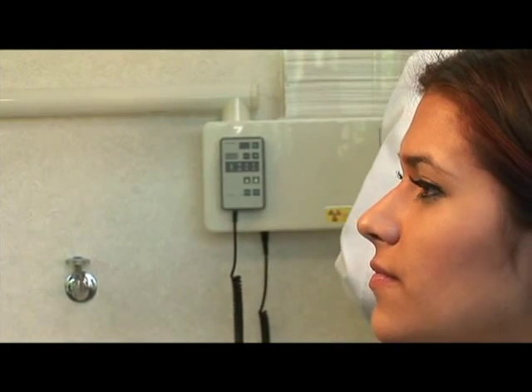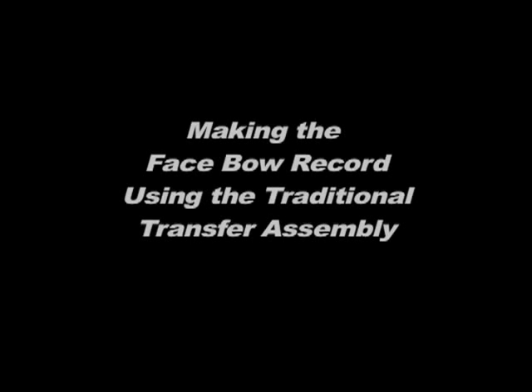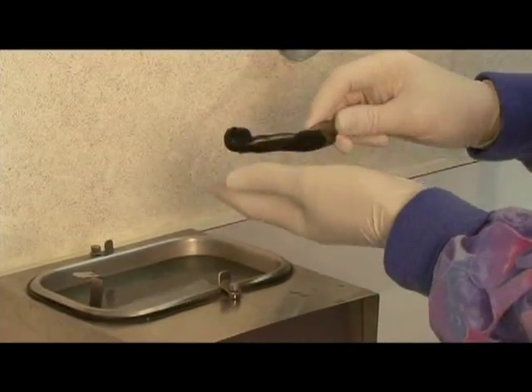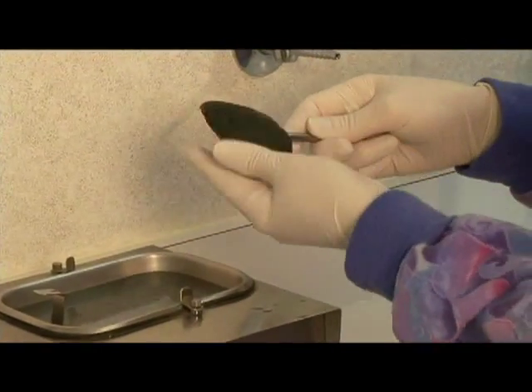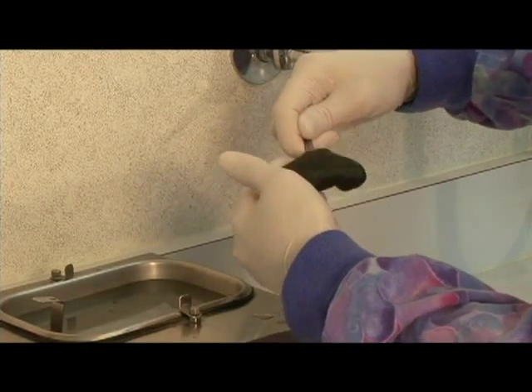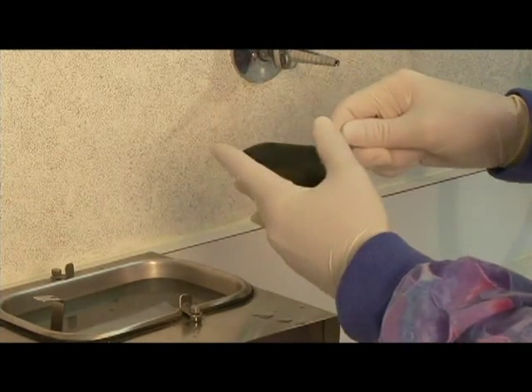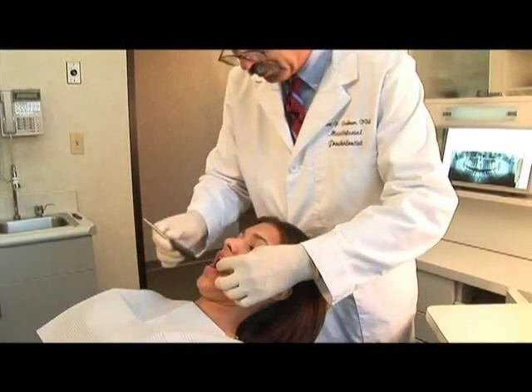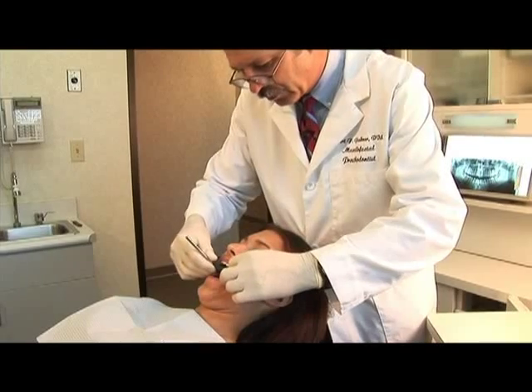This same procedure can also be performed with a more traditional transfer assembly. While there are a few subtle differences, many of the following steps illustrated will remain the same. The bite fork is prepared with the impression compound as was previously described. Place the bite fork into the mouth.